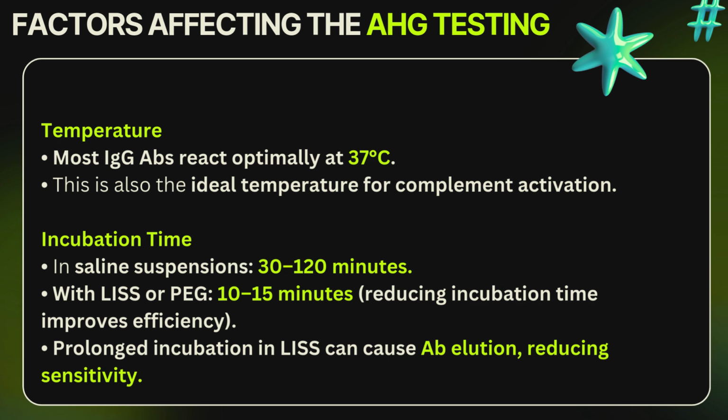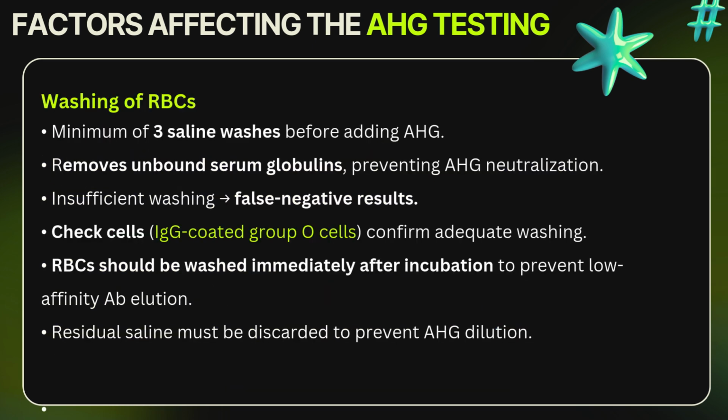It's important to note that prolonged incubation with LIS can lead to antibody elution, which reduces the sensitivity of the test. This is a crucial consideration for ensuring accurate test results. Understanding these factors and their impact on AHG testing is essential for accurate and efficient results.